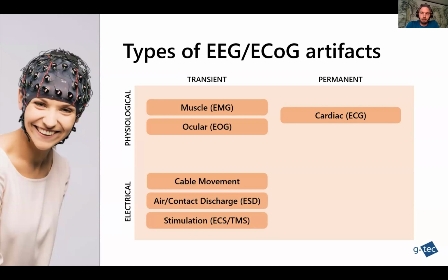Sometimes EEG is measured at the same time when you're doing stimulation. This can be, for example, TMS, transcranial magnetic stimulation, where you are recording EEG and you are injecting a magnetic pulse into the head with a very big coil. Yesterday we have seen an experiment. This introduces very huge transient artifacts on the EEG. For invasive recordings, there is electrical cortical stimulation, where you are injecting current into the brain. And of course, this charge transmission also causes large artifacts on the recording channels.